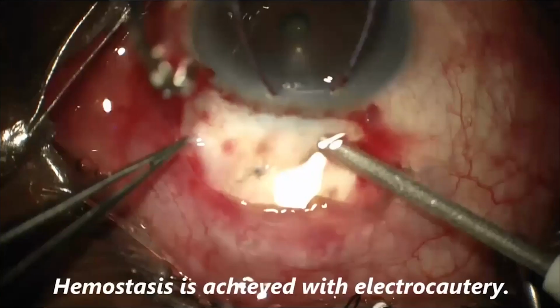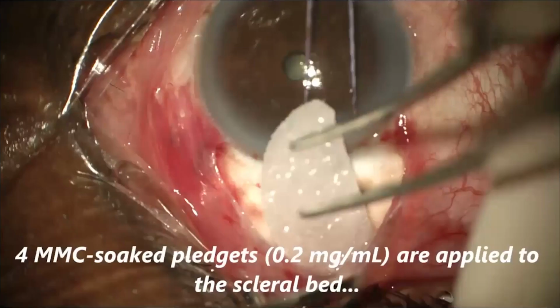I do like hemostasis with electrocautery. This is a procedure where you do need mitomycin C. And for the clinical trial, we all used the MitoSol kit. So we use mitomycin C on 4 half-moon soaked pledgets, 0.2 milligrams per ml, and we put these deep into the pocket, and we left one of the pledgets near where the distal end of the device was going to exit the sclera.